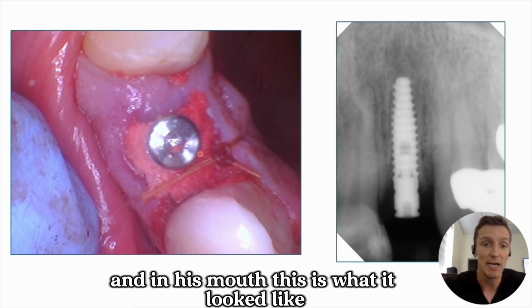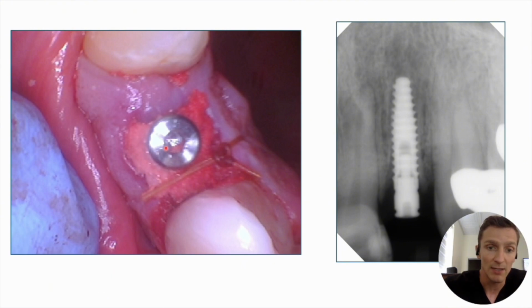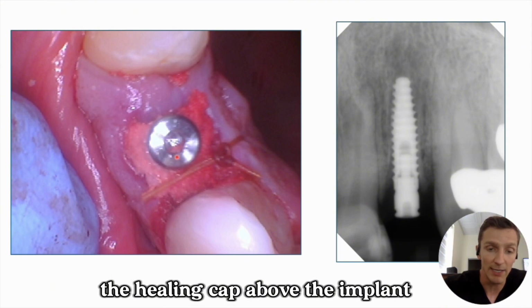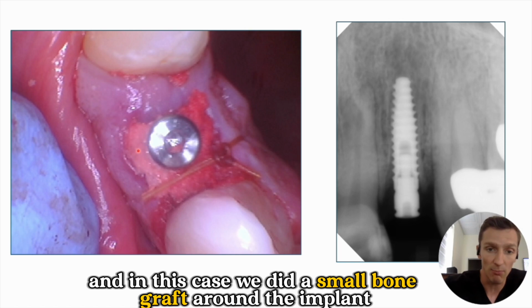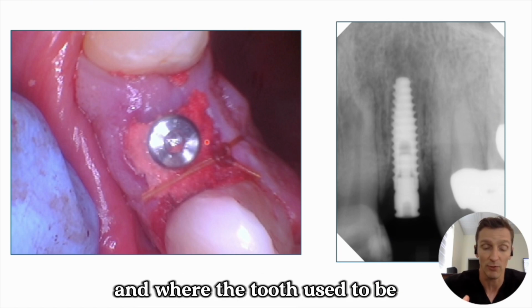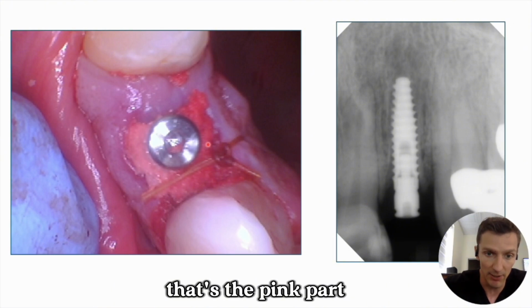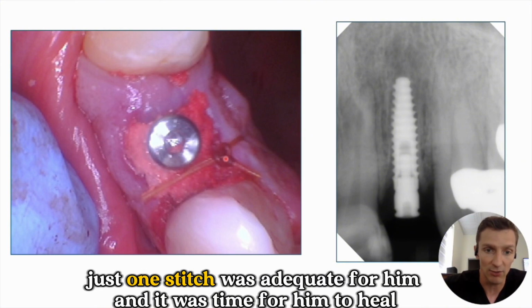And in his mouth, this is what it looked like. You can see the larger hole where the tooth used to be, the healing cap above the implant, and in this case we did a small bone graft around the implant to fill the bone space between the implant and where the tooth used to be, and put a little collagen over the top. That's the pink part. Just one stitch was adequate for him, and it was time for him to heal.